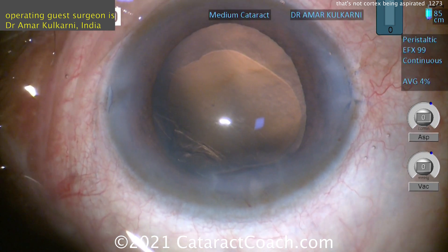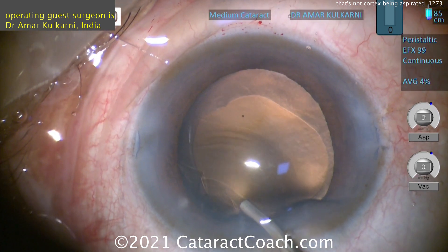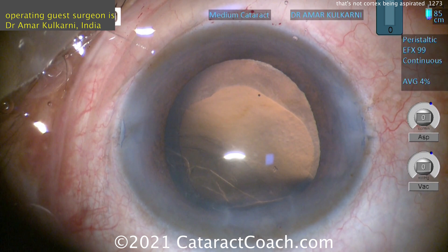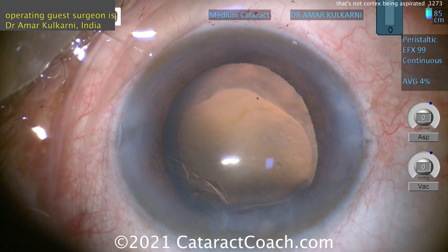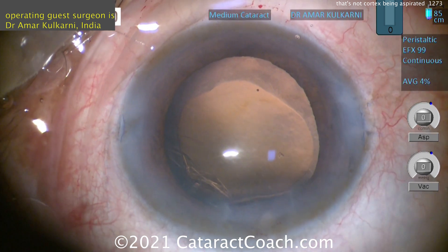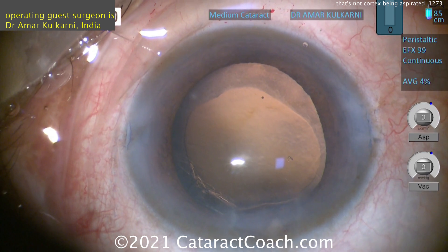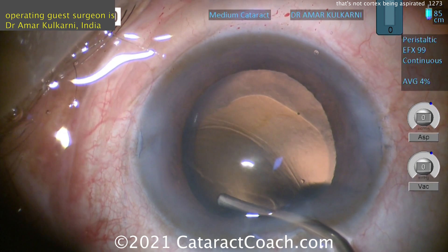So was this traumatic from ahead of time or was it iatrogenic? Hard to say, but either way we know what we need to do. We need to put in more viscoelastic and find that CTR. The CTR is coming — and again, you can put it in manually as we showed you last week, or you can put it in with an injector. Either one is okay. More and more viscoelastic.